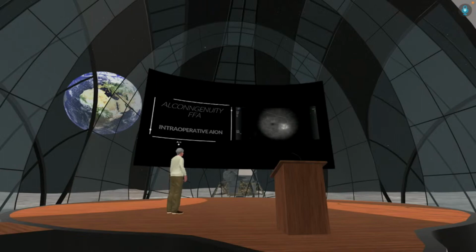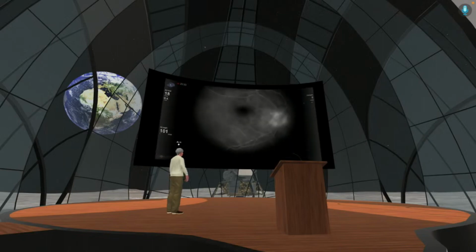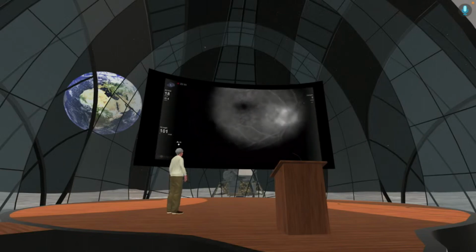Now this one was really interesting because during the surgery we noticed that the optic nerve is somehow pale, and this is the beauty of teamwork: even the surgeon, focused on a certain particular step during the surgery, the surrounding staff can point out things that the surgeon can miss. And this is exactly what happened here. One of my colleagues said something is wrong with the optic nerve.